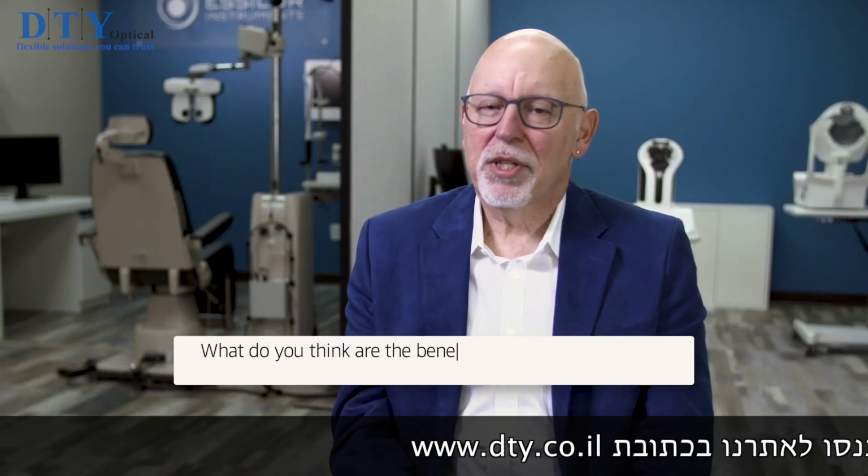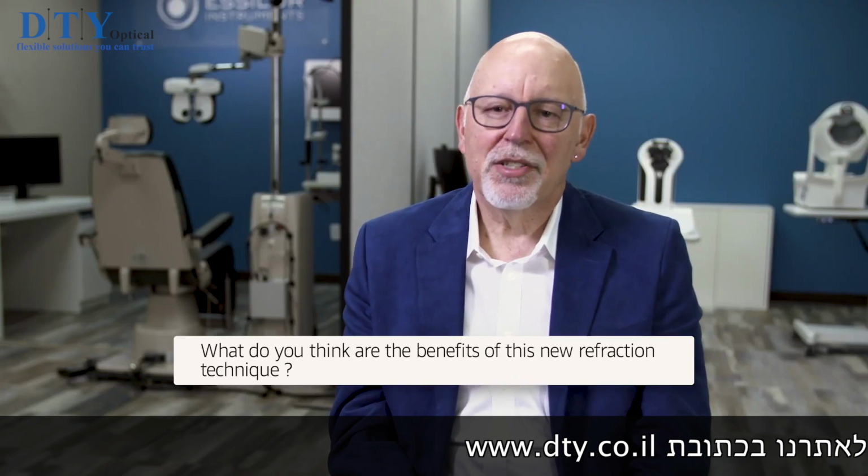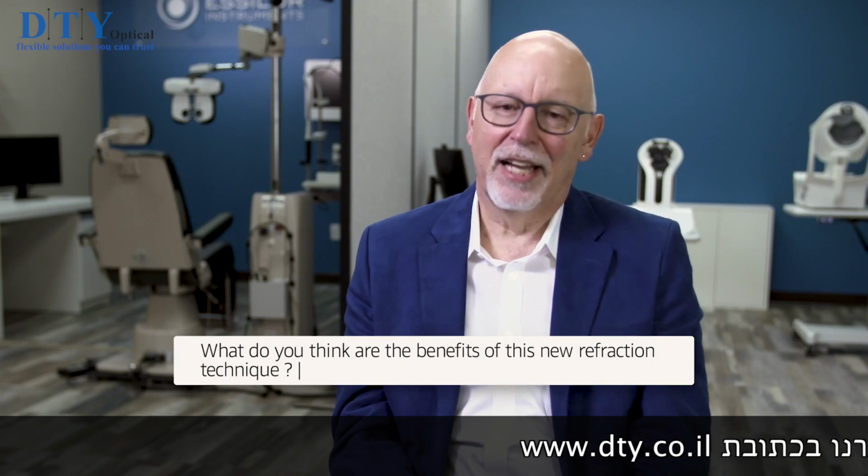Well, because we're stuck with a lot of moving lenses and analog technology, we're limited to quarter diopter steps, okay? So the lenses are in quarter diopter steps, in part because that was the way we used to surface lenses. Well, now, as I've already said, we have digital surfacing.